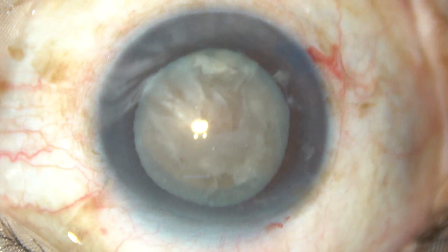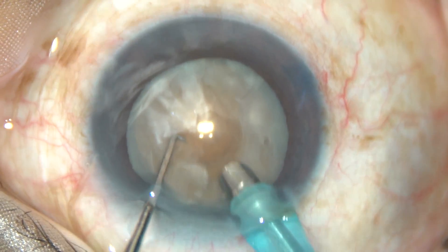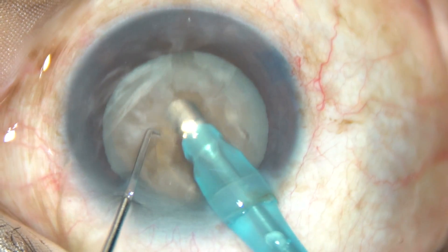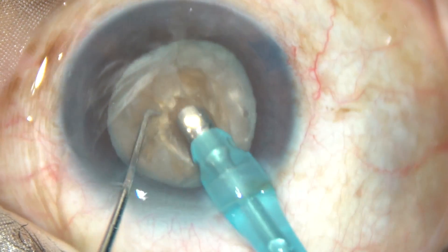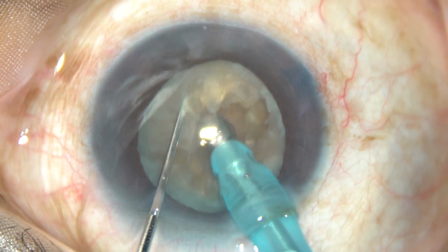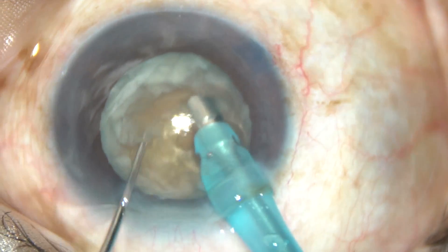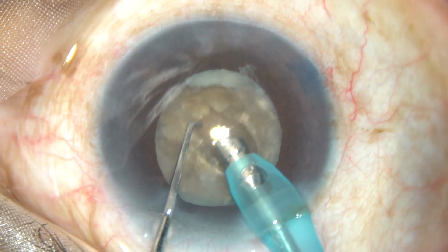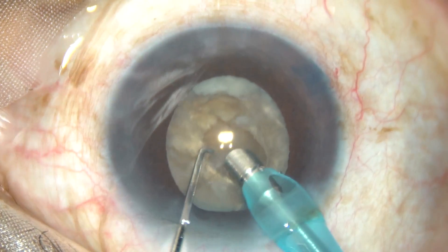Viscoelastic substance is again injected — this is HPMC. The tip of the phaco handpiece is introduced. I am in phaco on mode and in bevel-down posture of the phaco handpiece, meaning I am sculpting the anterior pole of the cataract and going deep — making a crater. This is called crater and chop technique, described by Professor Gimbel of Calgary, Canada.